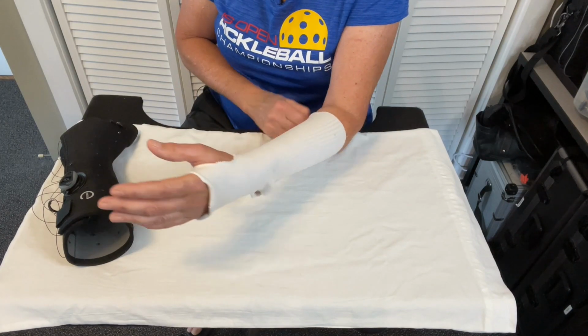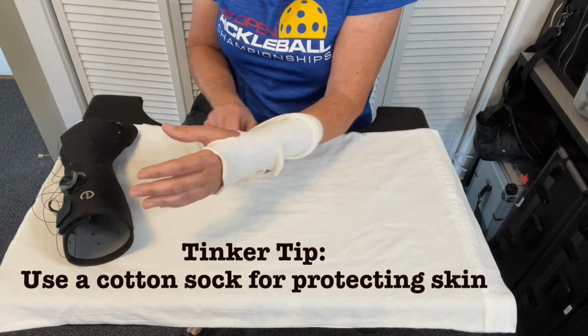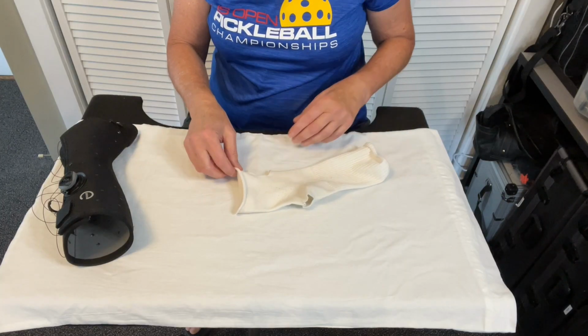But then, you know, it's summertime, it gets hot and sweaty. If you do sweat in this, it can be irritating on your skin. So as you probably can tell from this, it's a sock. I just took a cotton blend sock and cut the toe off of it. I cut a little thumb hole for my thumb to slide through.